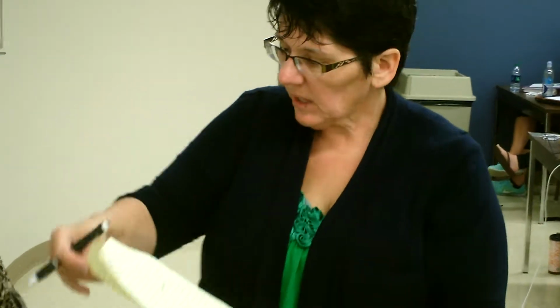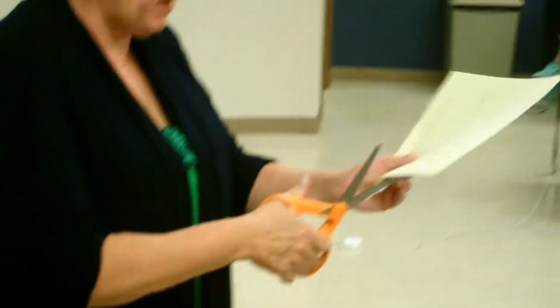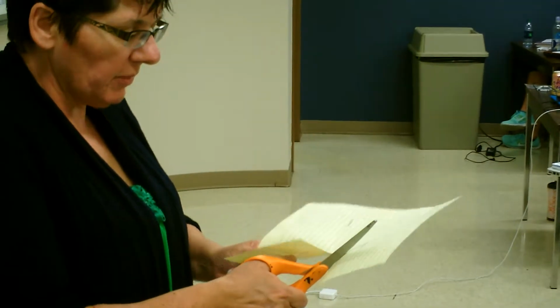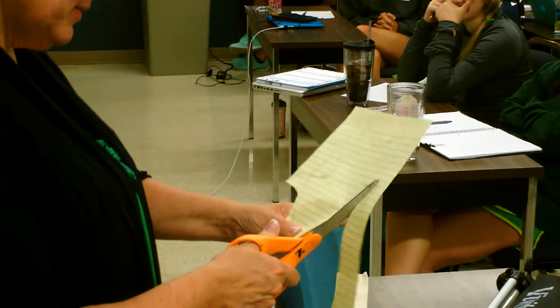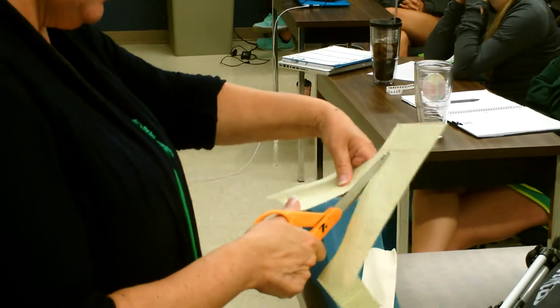Okay? So, once we get our design, we use these scissors to cut our pattern out. Now, my pattern is not long enough because of my paper, but once I get it on the thing, it's like paper dolls. Doesn't take much to amuse me.